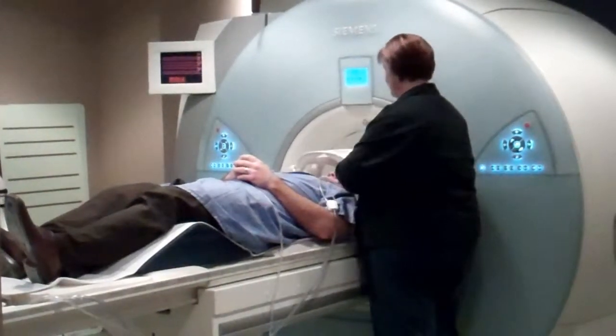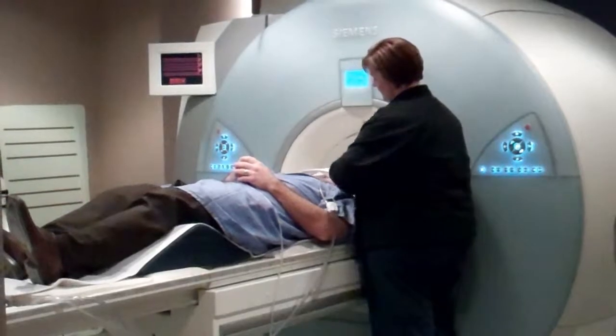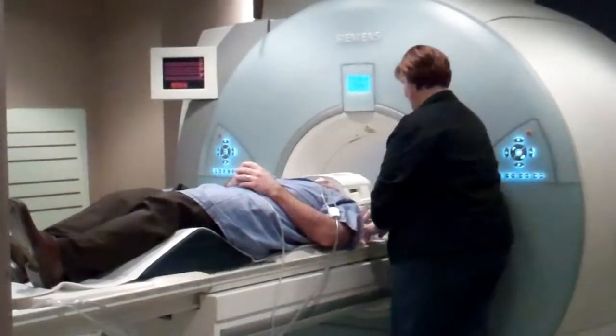Younger children can have a story, just to help with the noise and also pass the time. Most MRI exams take between 15 minutes to upwards of an hour, depending on what we're scanning. We inform the patient what they need to do and the importance of staying still. Sometimes they also have to have an injection of contrast, and we let them know when we'll come in to give the injection and the importance of not moving between pictures.